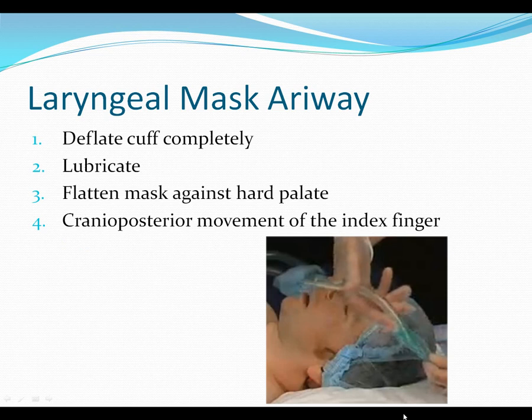Anyone know who invented the LMA? Dr. Brain. So this guy, over years and years, just sort of fiddled with these models of masks and tried them out on patients, and eventually came up with what is basically the LMA. And over those however many years, he basically used this device on thousands of patients. And so what I'll run through is his way of inserting the LMA.